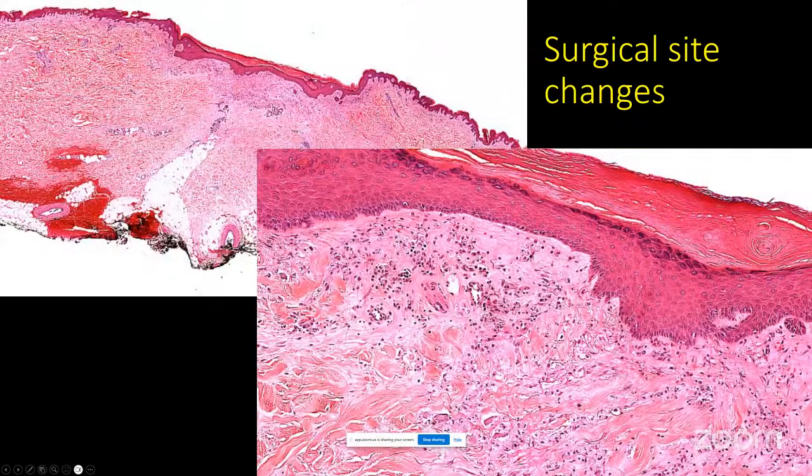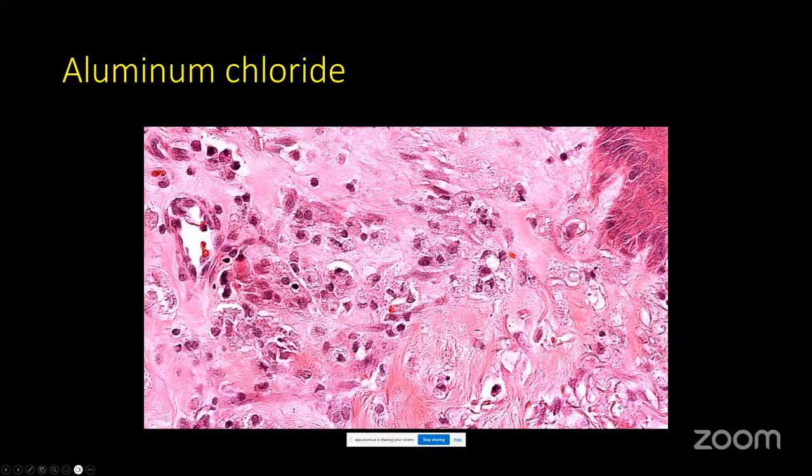Another cause of deposition, you can see here, normal, normal, normal. Then the epidermis is effaced, and then there's some subepidermal fibroplasia. And if you look here, you've got material that's sort of a grungy purplish. Again, these are from the prior scanning system, so I apologize, they're not great.